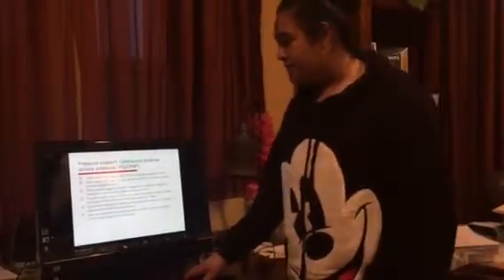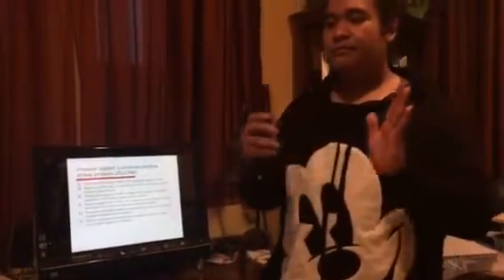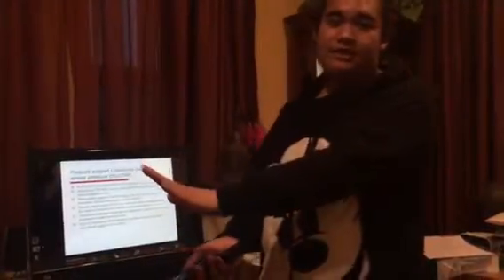So basically, the overall take home part for the pressure support CPAP is that the ventilator is just giving a support so that it could help the patient move towards breathing on their own only. So it's just helping the patient walk through being by themselves, or being independent rather.